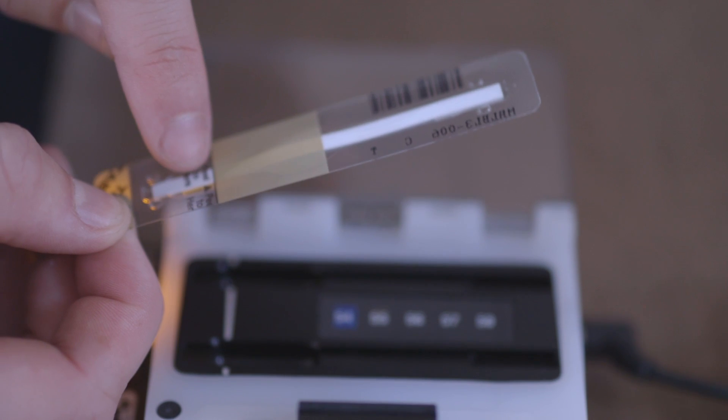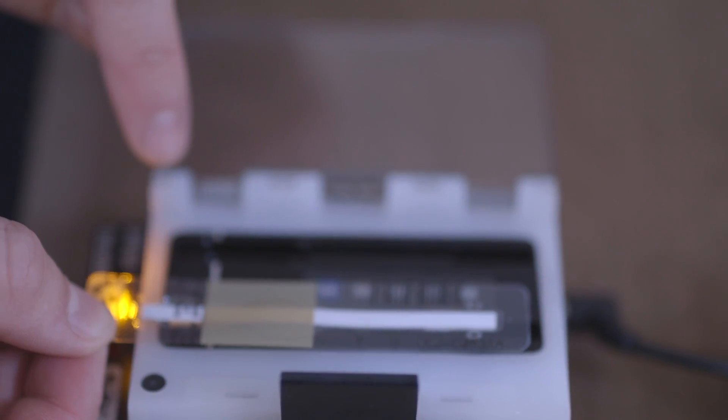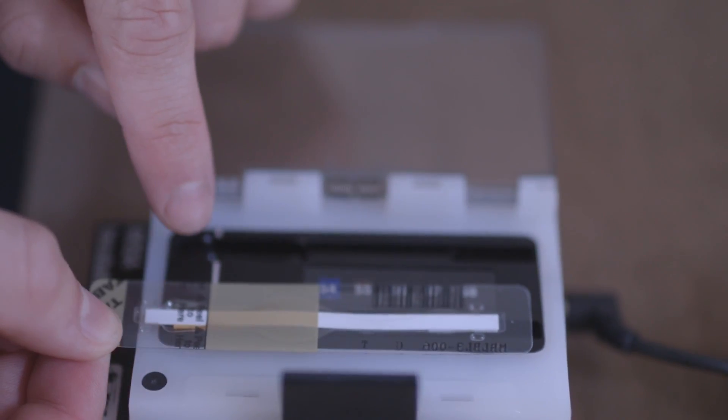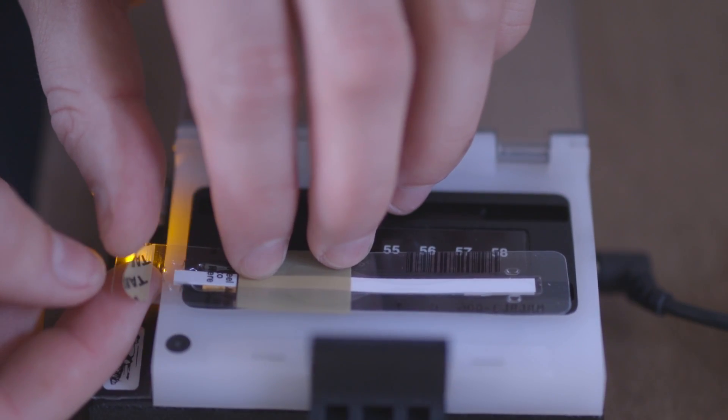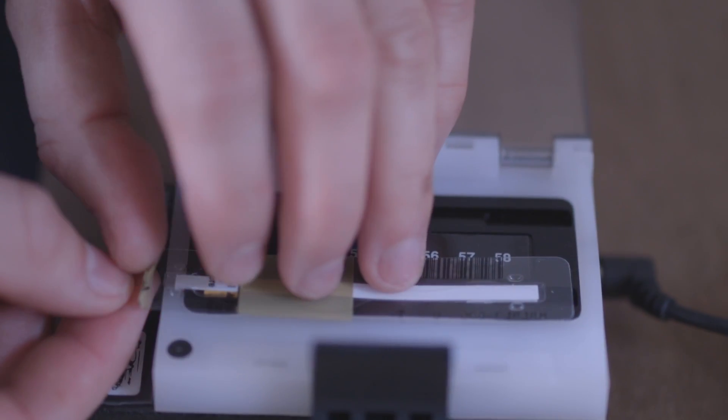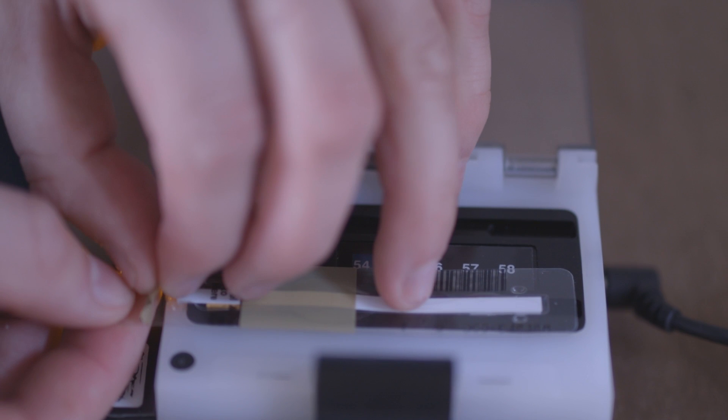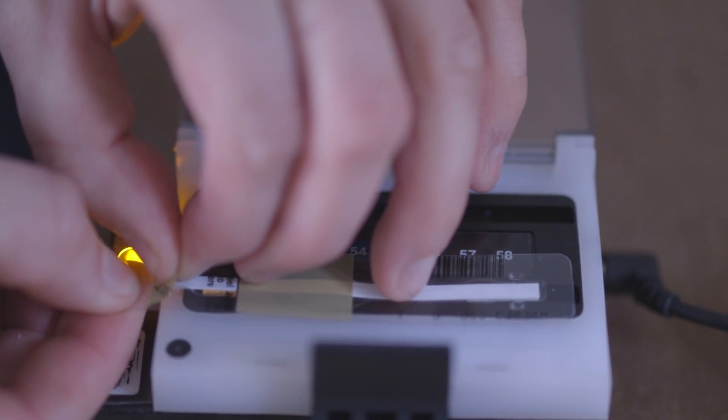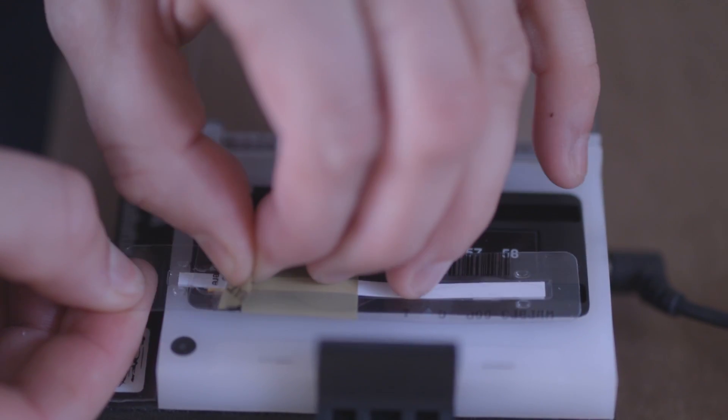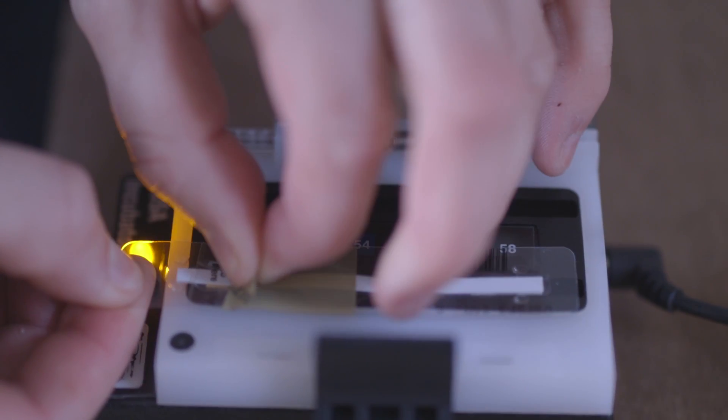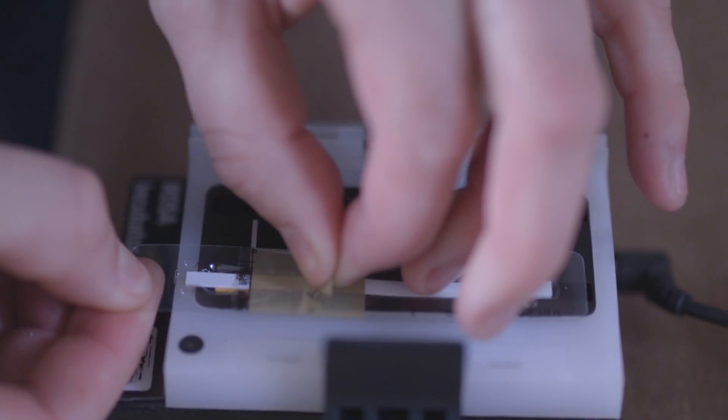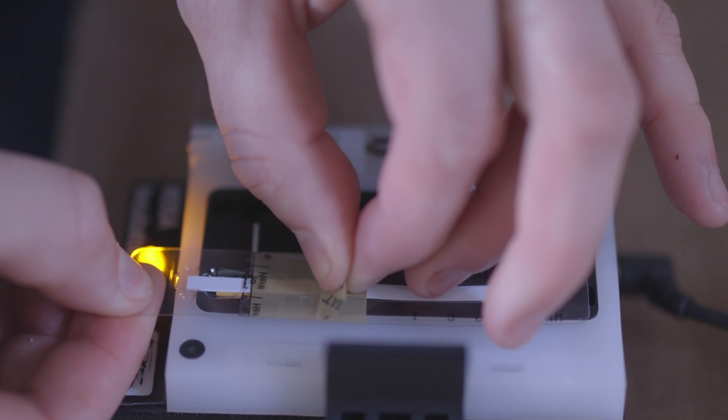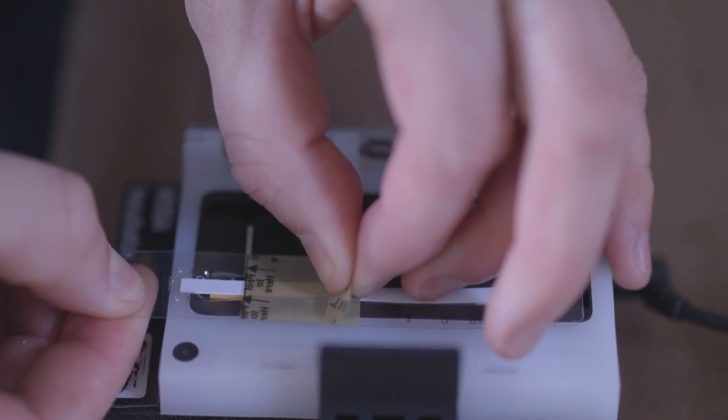We start by placing the Charm Strip in the incubator. We peel back the tab on the bottom of the strip while it's in the incubator. It's very important that we do this while it's in the incubator as we can damage the strip if it's not done well in the incubator.